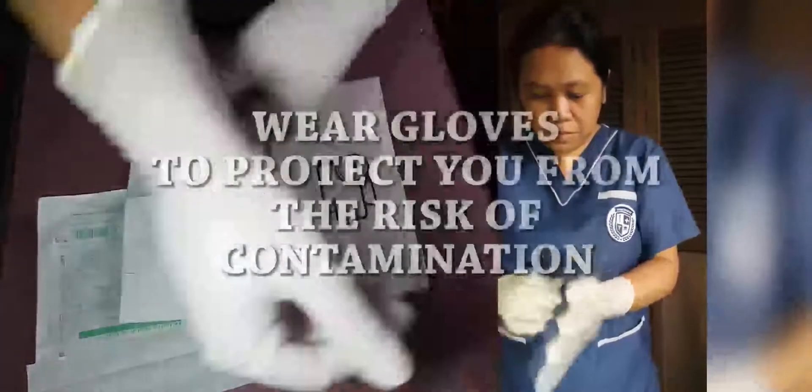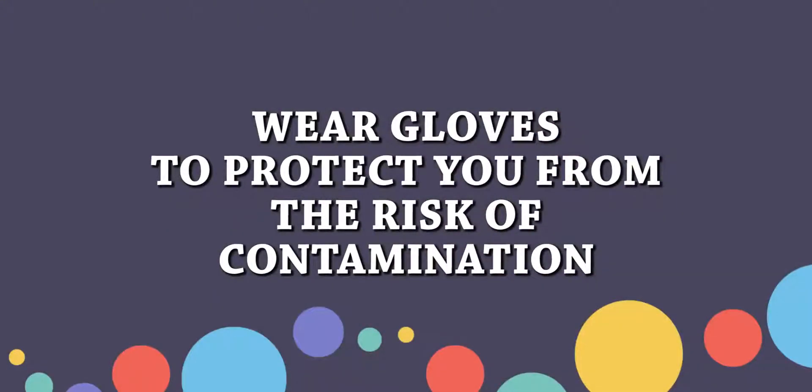And then, wear your gloves. It is important to wear gloves to reduce the risk of contamination.